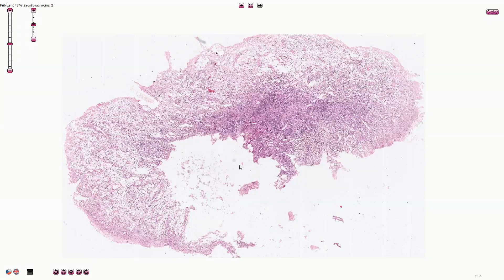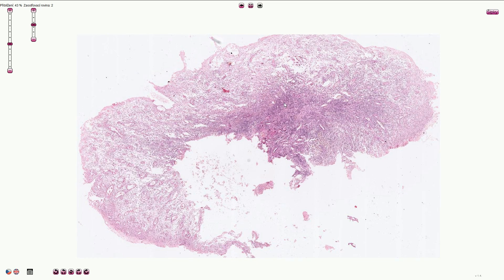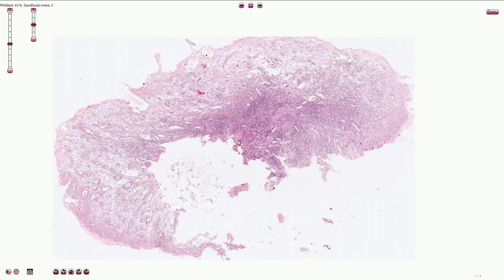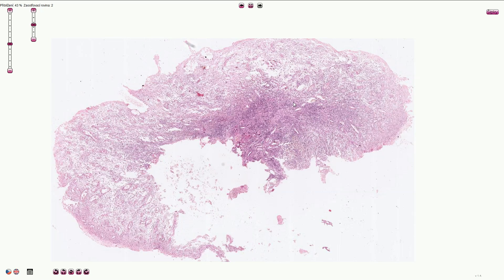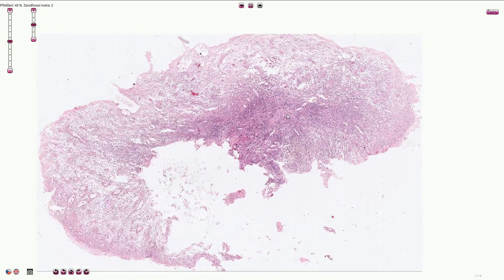Here we see granulation tissue. Granulation tissue is very important in the healing process — it is basically the way the organism creates new connective tissue. So if you cut yourself, the wound will be filled with granulation tissue. Another example is myocardial infarction, where coagulative necrosis after some time will turn into granulation tissue and over time it will heal and create scar tissue.